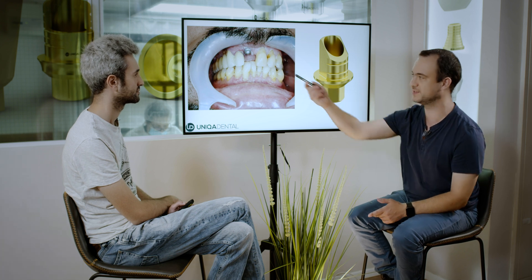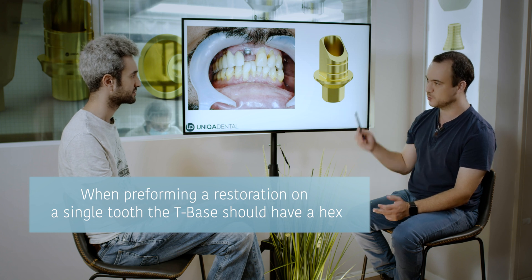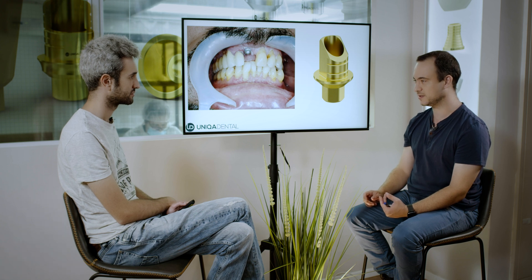In the frontal teeth when you load just one implant, for example a central incisor — after, if it's not immediate loading, you can take the same pressure, it won't rotate on its axis. In these cases the most important part is when you use a T-base, you want to have a T-base with a hex, with an anti-rotational element between the implant and the T-base. So it won't rotate. If it won't rotate, it won't unscrew. If you have a round T-base for a single implant, it can rotate and these micro movements can unscrew the screw and the crown will start moving.